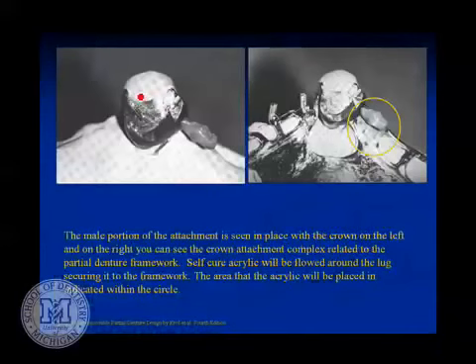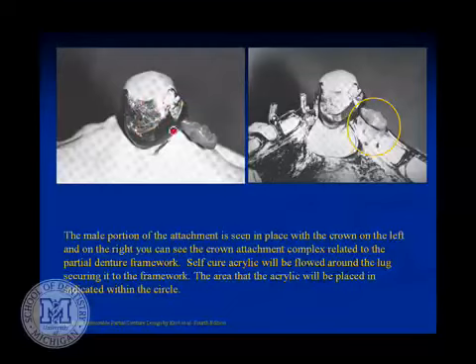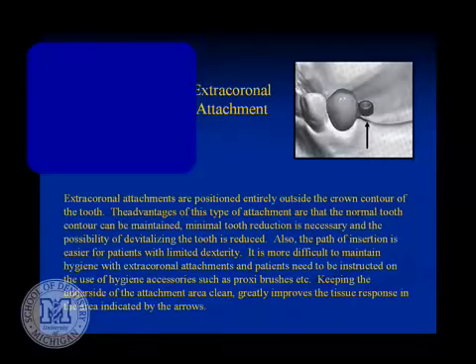So here's our crown that's all cast completely. Here's our male attachment in the crown, so the male and the female attachments are mated, and we're now making a pattern, typically in Duralay or GC pattern resin, of this little tail with the lingual reciprocal arm. And so this is taken off and cast in gold and soldered to the male.